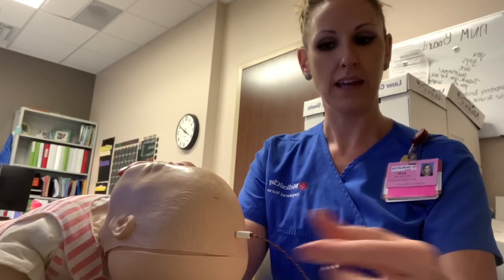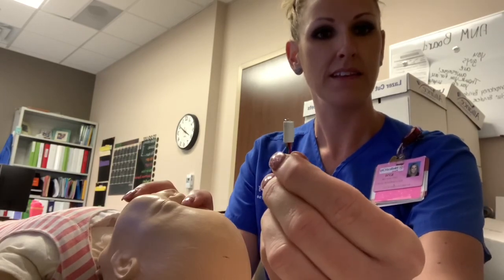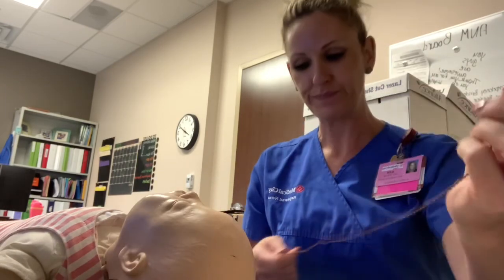In order to remove the fetal scalp electrode that is on the fetal head, it is going to be a counterclockwise turn. So we're going to take it, we're going to do counterclockwise, and then it comes off. We always want to make sure that the tip is intact and document that.